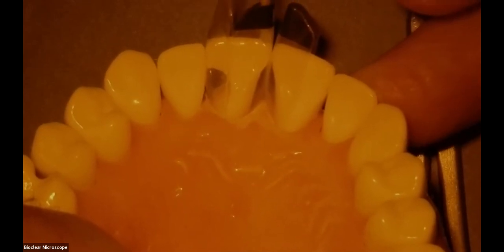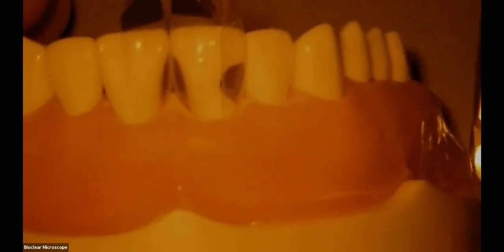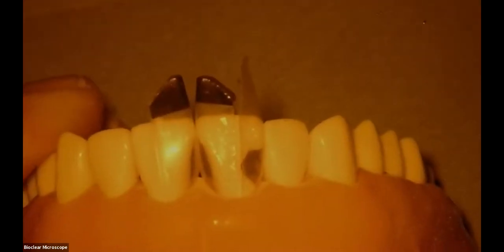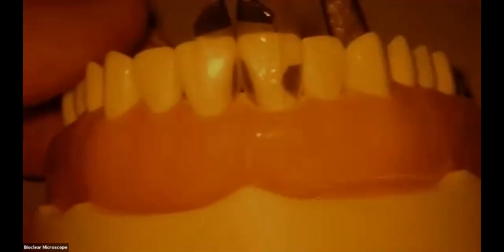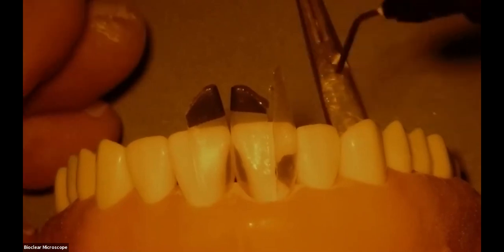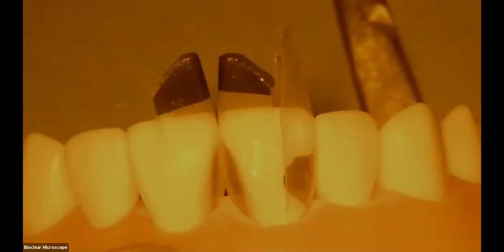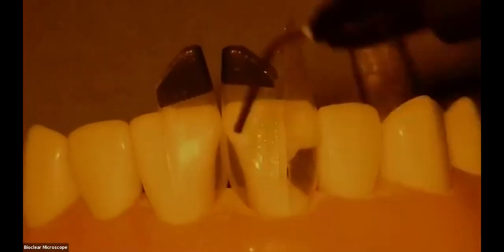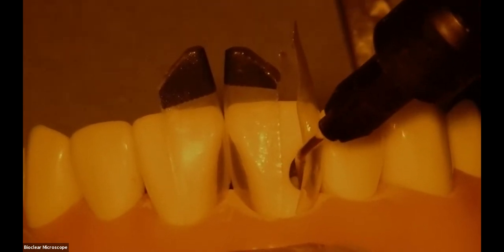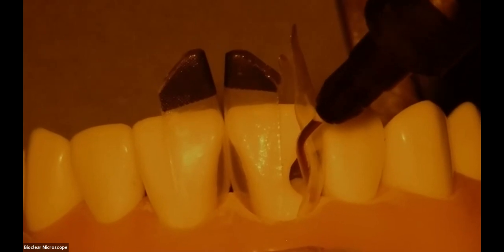Now we're going to air thin this, but not light cure. Now we're going to inject the heated flowable composite. I've got all these things in the heat sink heater, and that's at about 68 degrees centigrade, I believe. We're going to inject the heated Filtek Supreme Ultra Flowable at about a 45 degrees, starting at the palatal, coming out to the facial.